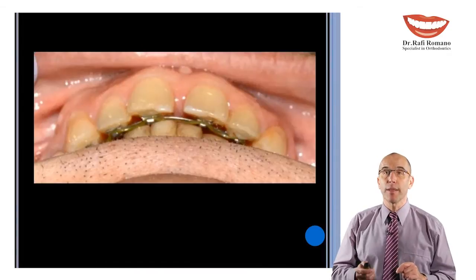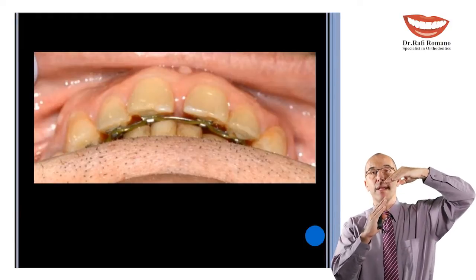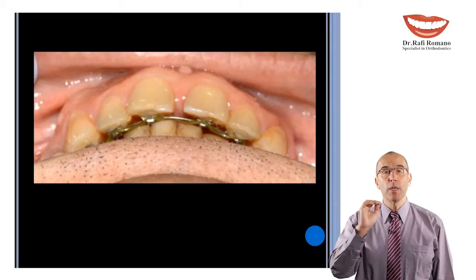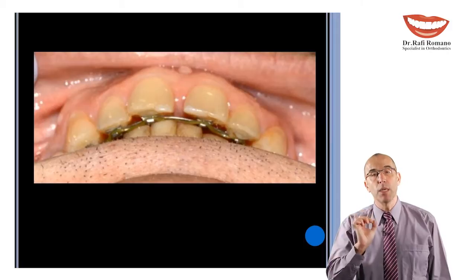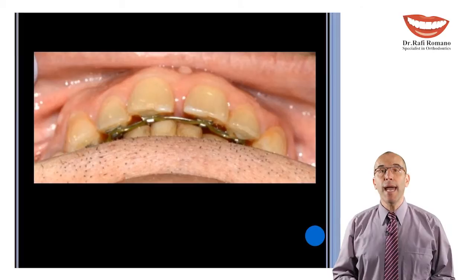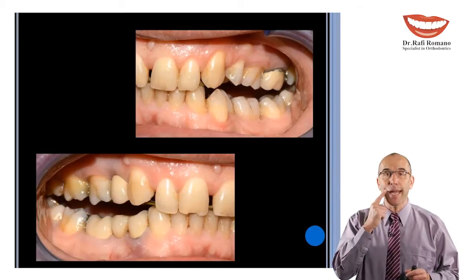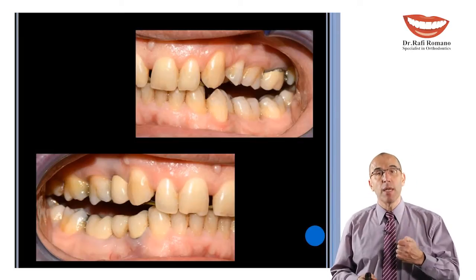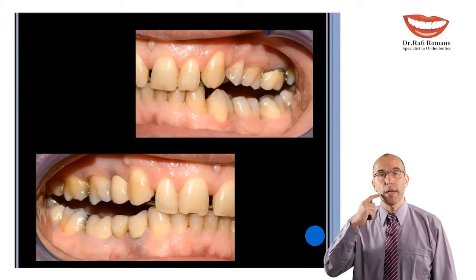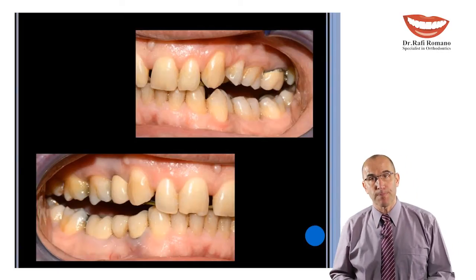Look at the posterior, look at the anterior, and see here the contact between the lower teeth and the bracket. Because the Joy brackets are so small and comfortable, he had very, very minimal interference from the brackets on the occlusion, but he had some bite opening from the back because of these brackets. So we had to support it and plan it in advance with composite on the posterior area in order to give some relaxation to the mastication muscles.